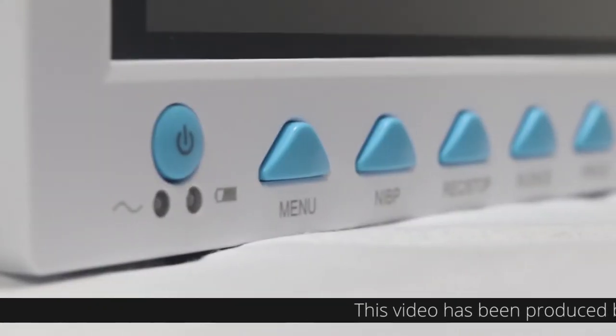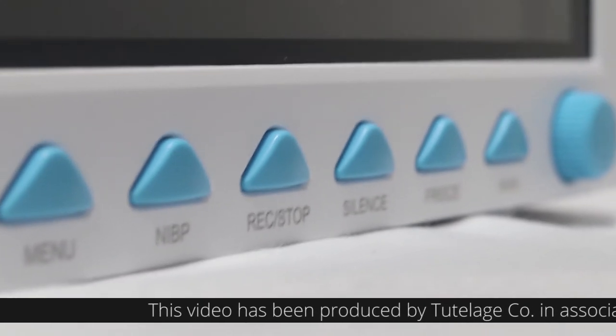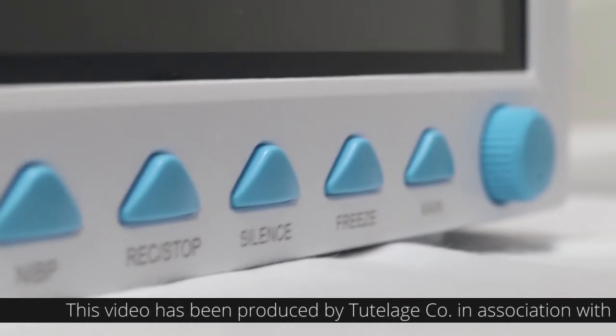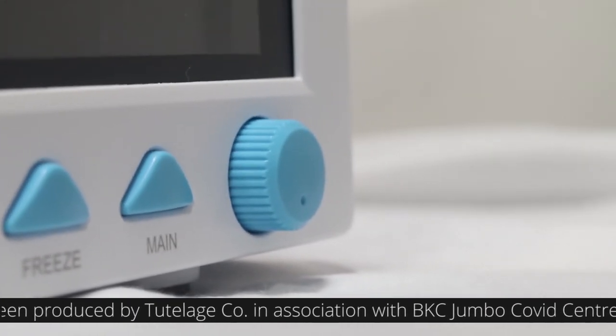The front panel has the display, below which there is a power button, the operations buttons: menu, NIBP, record or stop, silence, freeze and main, and a rotary knob.